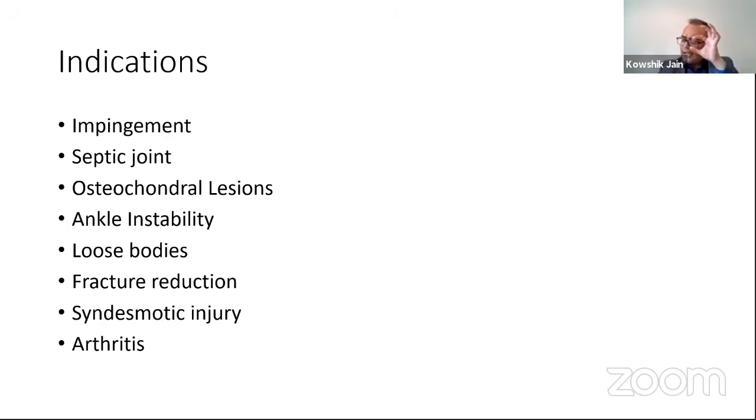Fracture reductions, I've got to admit, I don't use it for this particular indication. But when you're doing a pilon fracture or talus fractures or medial malleolar fractures, you can scope the ankle and then see how good the reduction is. Some surgeons do it, but I don't use it for this indication.